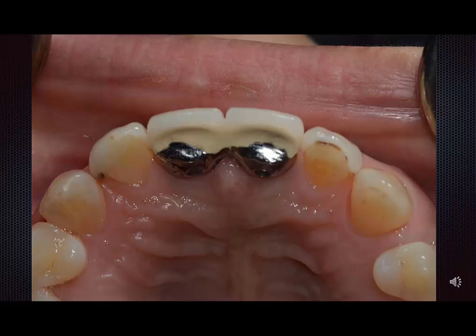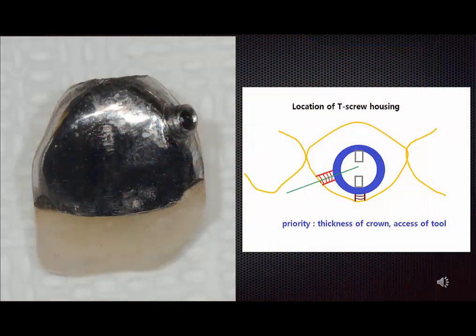It is an existing lateral screw type fixture, but it is inconvenient because the cingulum side is too thick. However, the next slide shows that the position of the lateral screw can be changed in the ALS system. The ALS implant system can be changed to the proper position of the housing when the cingulum side is thin. The rest of the information will be explained next.